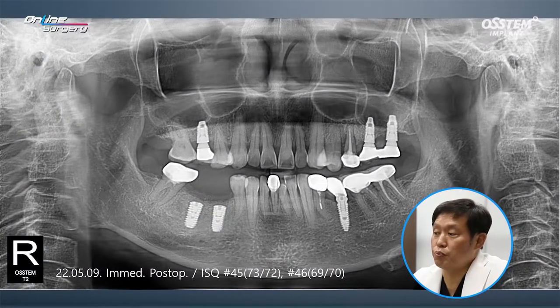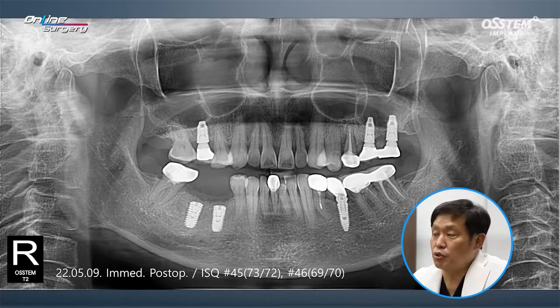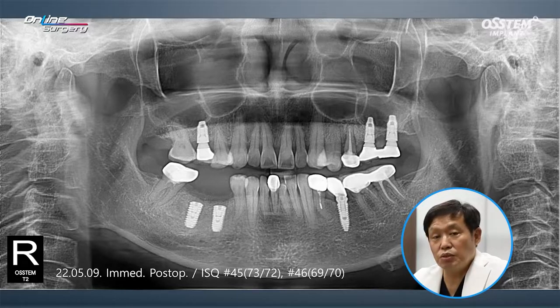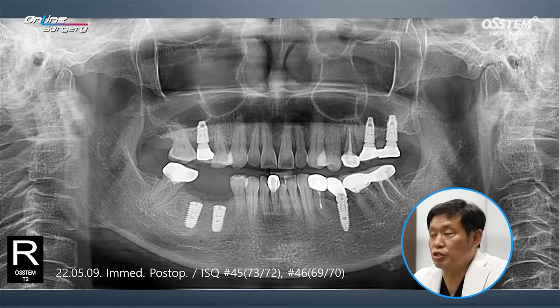This is the immediate post-op image. OneGuide was used and implants were placed as planned. Looking over here, bone grafts can be observed on top of the implant. At the time of implant placement, ISQ was 73 and 72 in number 45, and 69 and 70 in number 46.